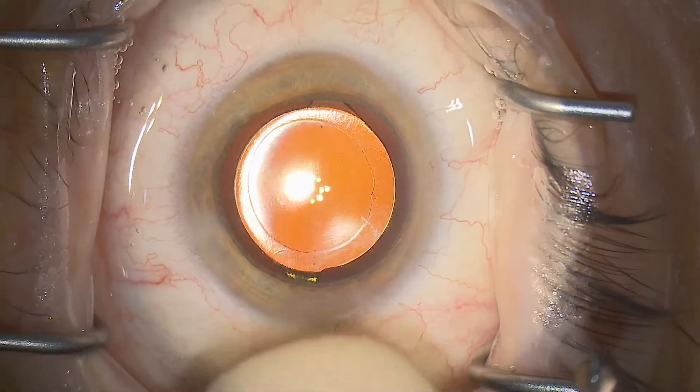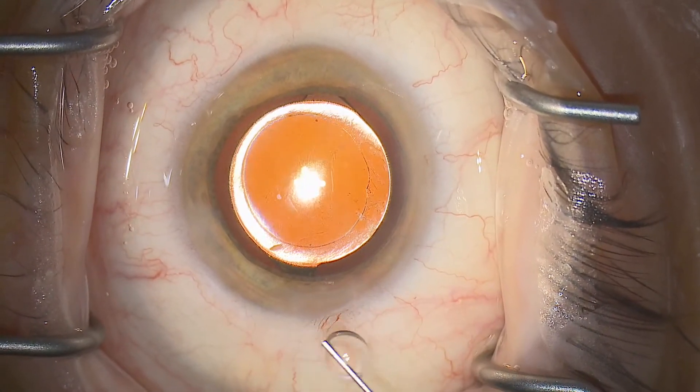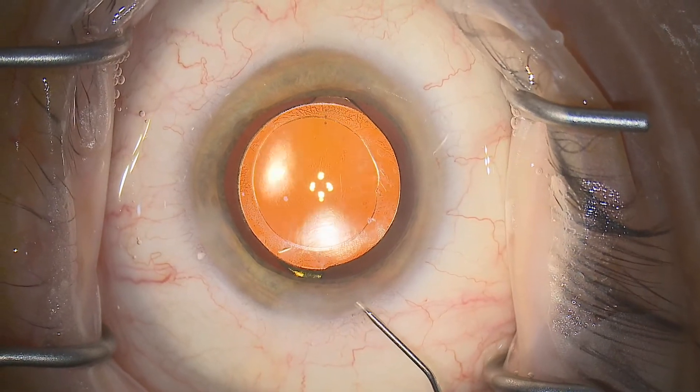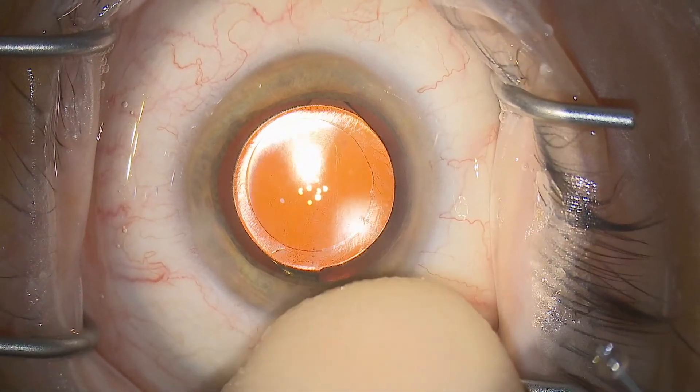The point being that the time to fix a problem with the sealing of the entry sites is right here on the operating table — not finding out in the recovery room half an hour later.